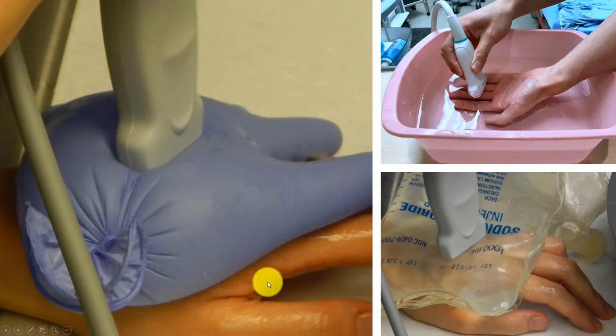There's three different techniques that I've seen with water baths that are performed. The one that I like the most is filling up a glove with water and ultrasounding through the glove. It's important when you do this to put gel on both sides of the glove, so put gel underneath the glove and on top of the glove. You can have the patient put their affected hand or foot into an actual bath of water. The probe itself is waterproof up until about this point, so you can submerge the probe into the water bath itself. And then last, you can use a bag of saline to ultrasound through that.